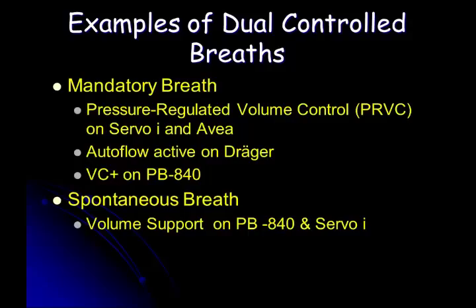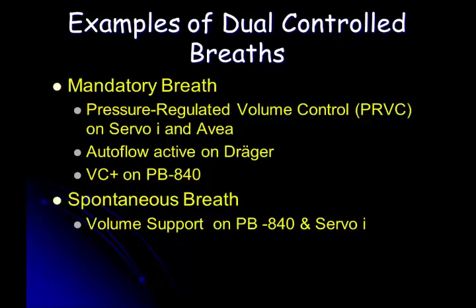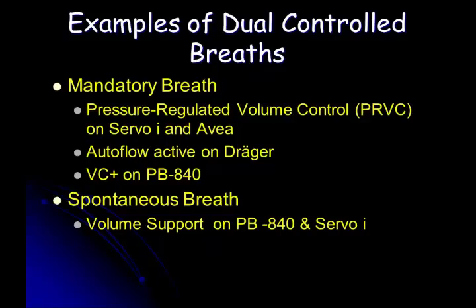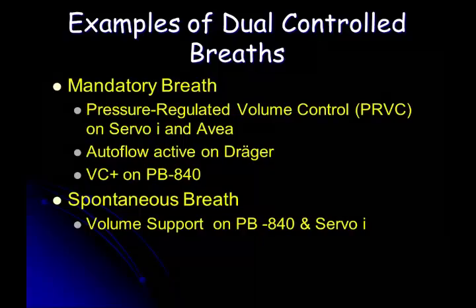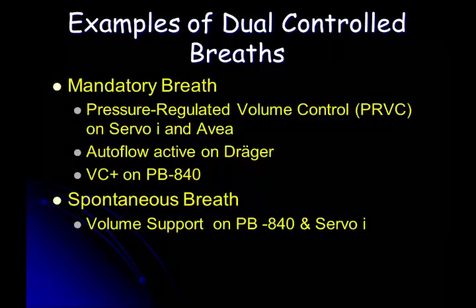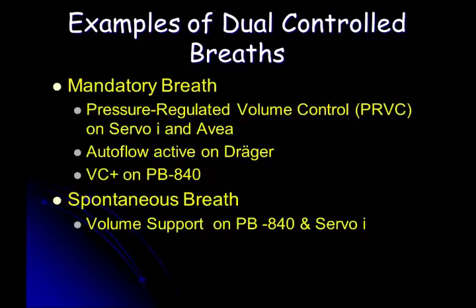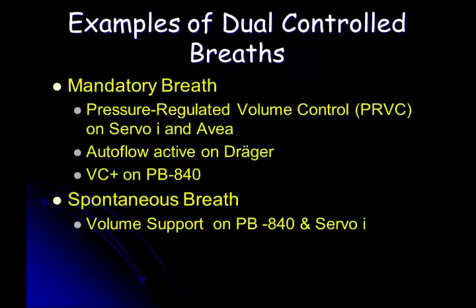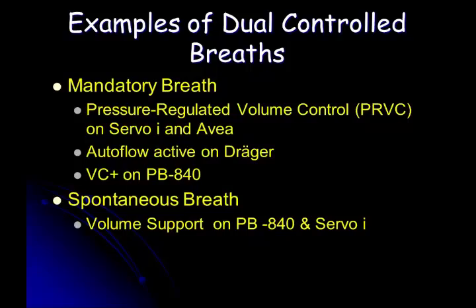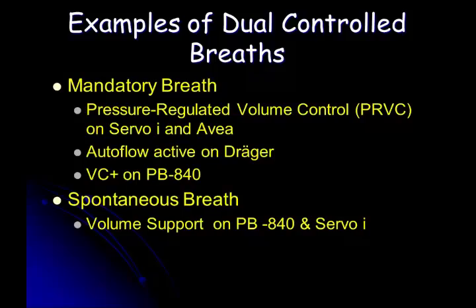Mandatory breaths. I'm going ahead and saying, please deliver 700. If it's only delivering 650 with a specific pressure, it bumps the pressure up a little bit. Looks on the next breath, sees where I'm at. If not, makes an alteration again. Go ahead. What happens in the face of high peak pressure? I mean, you're controlling the pressure, but if you do a bigger tidal volume, it increases your pressure. If it's not getting the desired tidal volume, it will go up on the pressure. Is there a safety mechanism that is built in so that we don't go above a certain spot? Yeah.